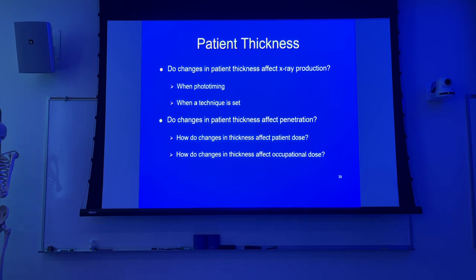And so our patient dose is going to increase in our obese patients, because with that absorption, we're talking about photoelectric absorption, patient dose is going to go up. Occupational dose can potentially go up if you're in the room in a fluoroscopic exam.